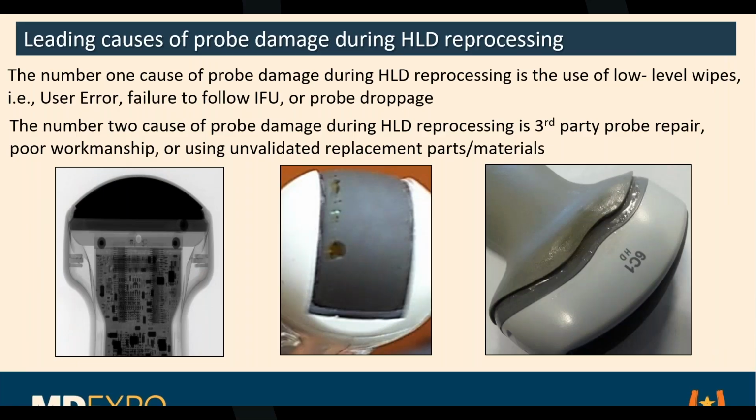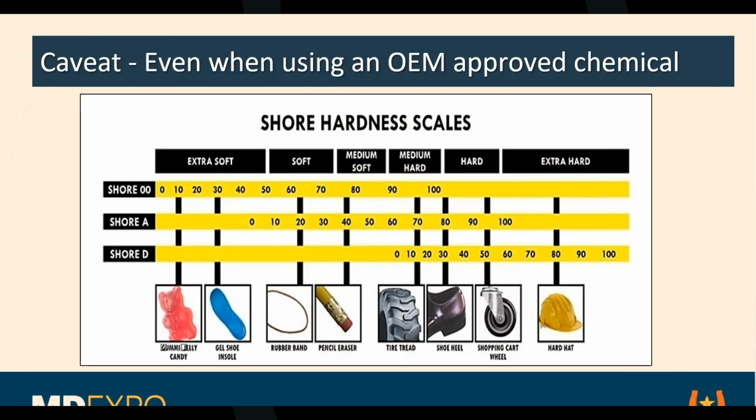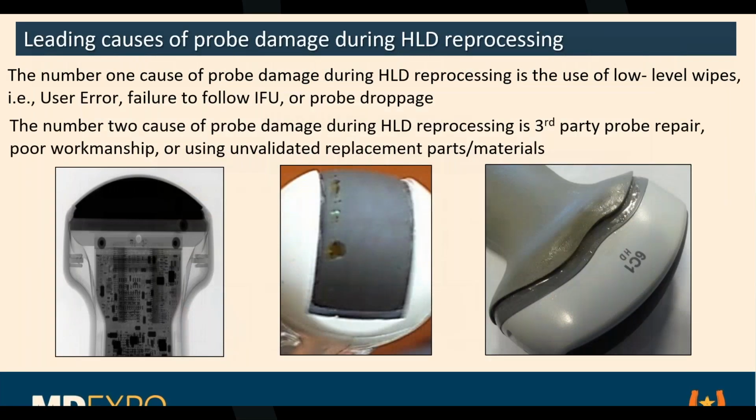So you put it back into service, and you've used materials that aren't as good as what the OEM used, or don't meet the same specifications that the OEM uses, you can cause significant damage. So can you go back, please? At what point do you determine if it's safe to use or not? Say you do all your testing and all the tests pass, but it looks like that. You would say it's safe to use or it's not?